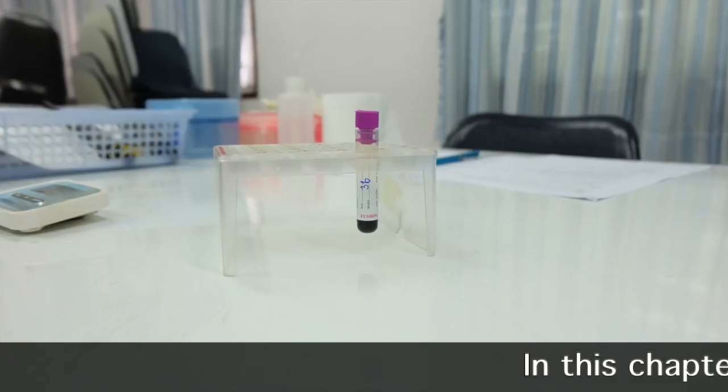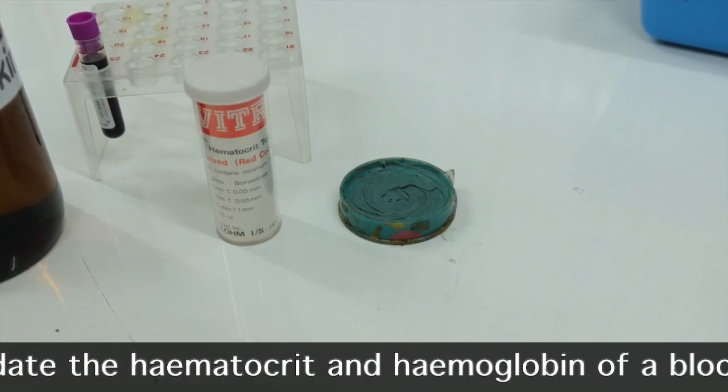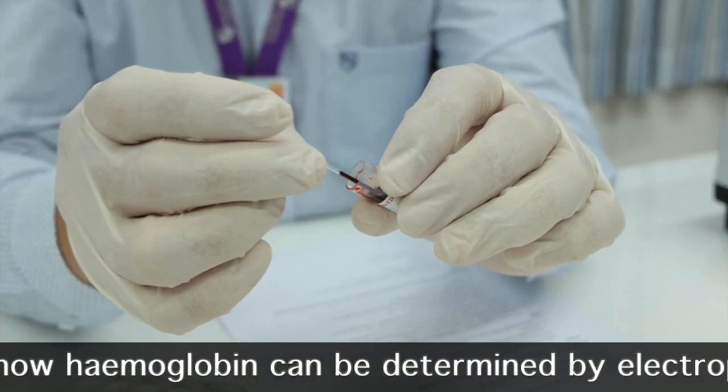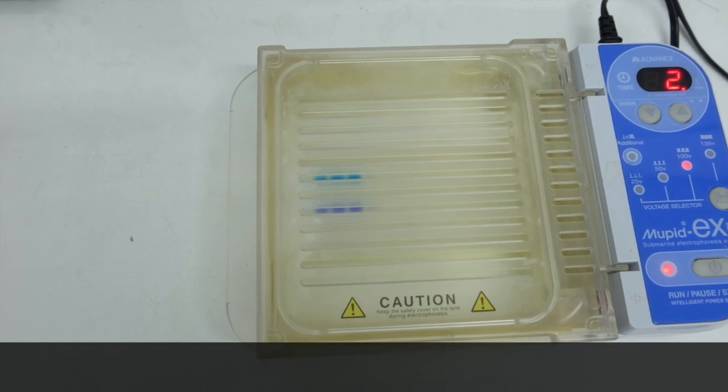Hemoglobin and hematocrit determination experiment. In this chapter, you will be able to elucidate the hematocrit and hemoglobin of a blood sample, and you will also have a further experience in learning how hemoglobin can be determined by electrophoresis.